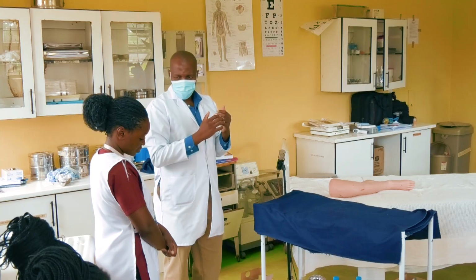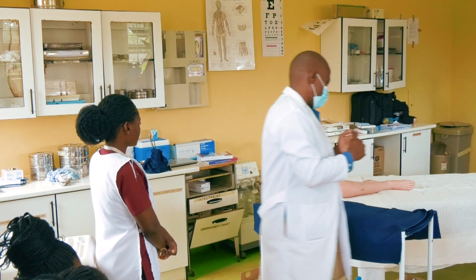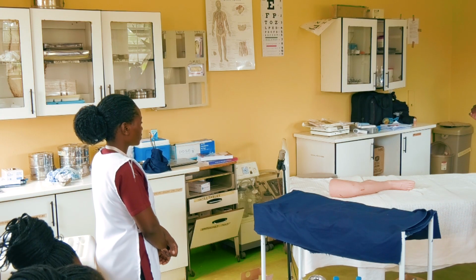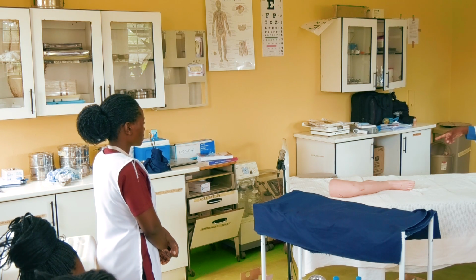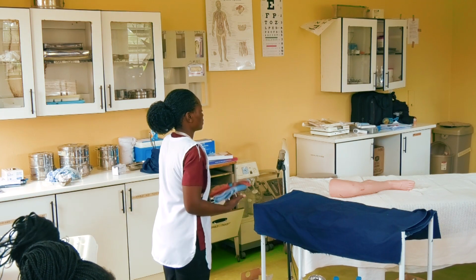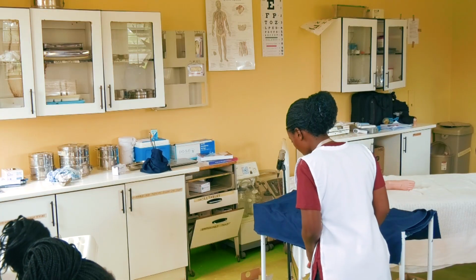So now the assistant, you have to tell your assistant what to do. Okay? I'll stand this side. Then I'll ask my assistant, you tell the patient, oh, I'm back now. We're about to start doing this. So, anyway, one step forgotten, still the assistant can help. My assistant can put that Macintosh under the foot or under the leg of the patient. Get them one, the way you get them. Just come, move quickly.